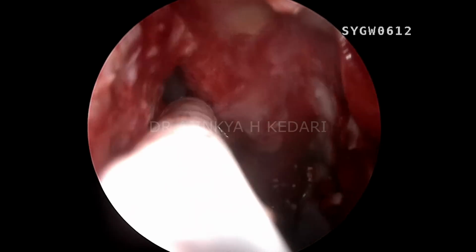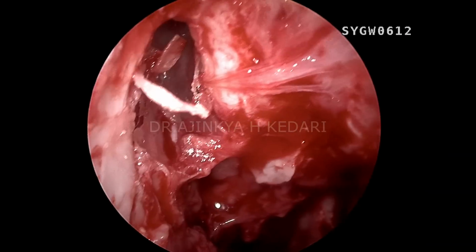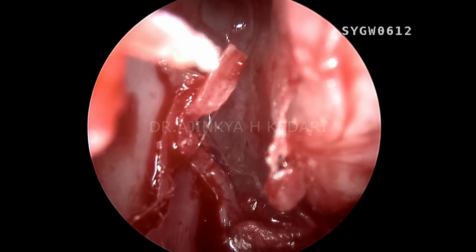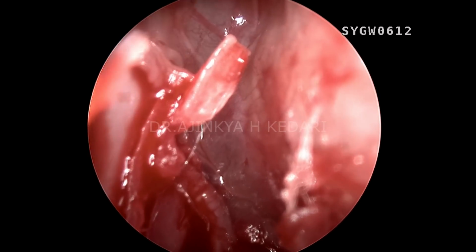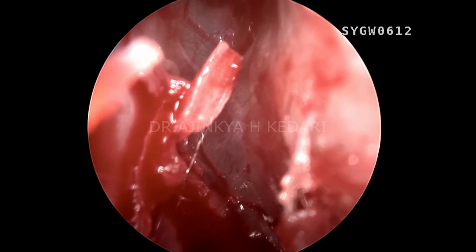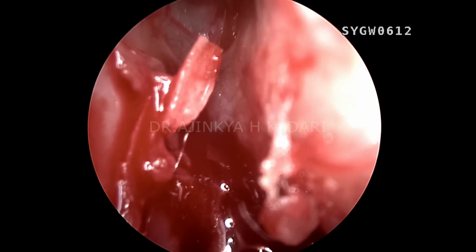And now you can see that's the secondary site, the second site of CSF leak behind, which I'm going to go and explore right now. So already I've done the full house FESS. I'm just going to decongest this area. You can see the CSF flowing out very mildly right now. At your 12 o'clock, that's the CSF leak happening, and that's some capillary ooze down there at 6 o'clock.